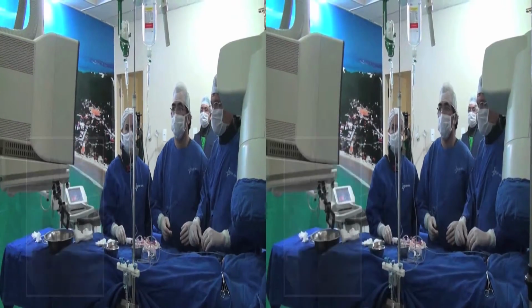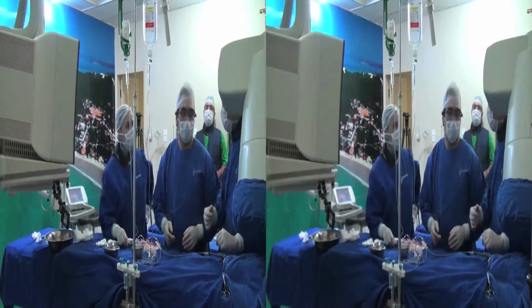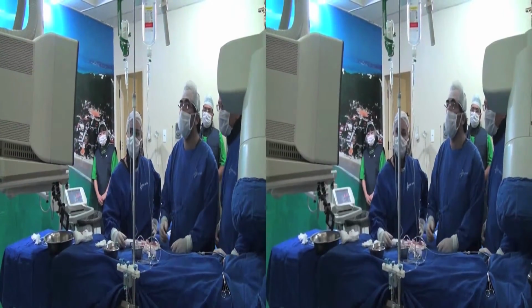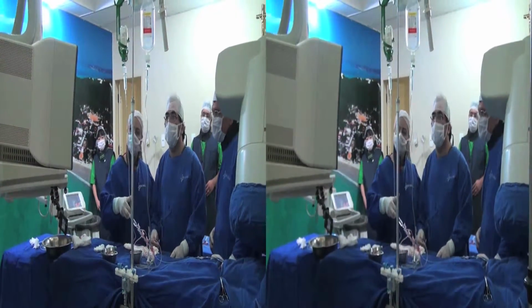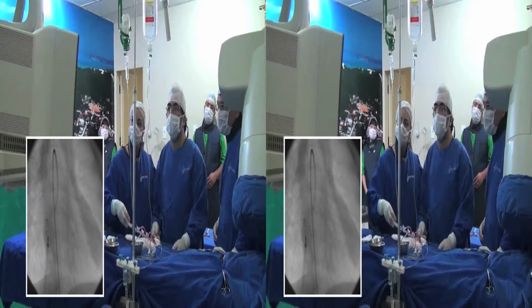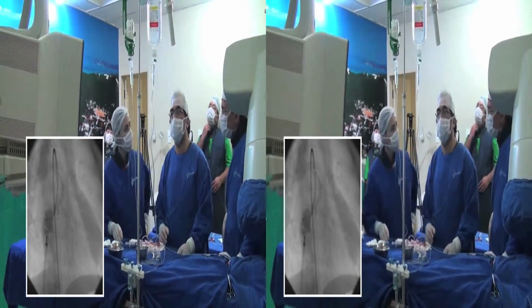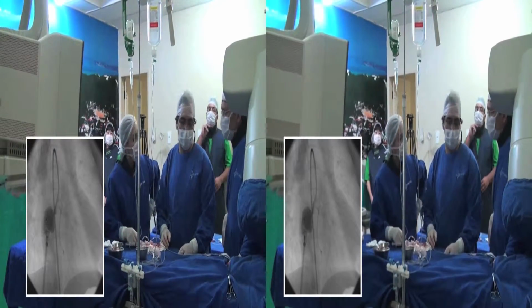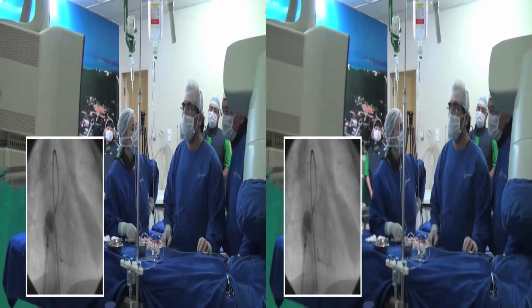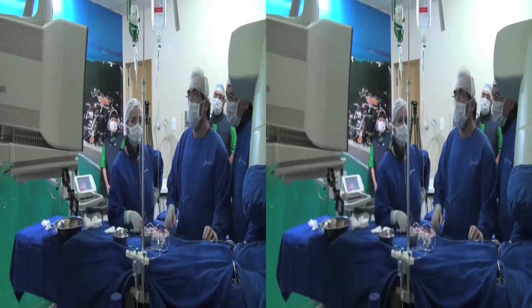We performed a test for this catheter coming through the aortic artery. Now our goal is to release it in exactly that position. In this image, we can observe the prosthesis being released, but still attached to the catheter. See that there no longer exists passage of the contrast injected into the fistula. This was repeated in another projection.